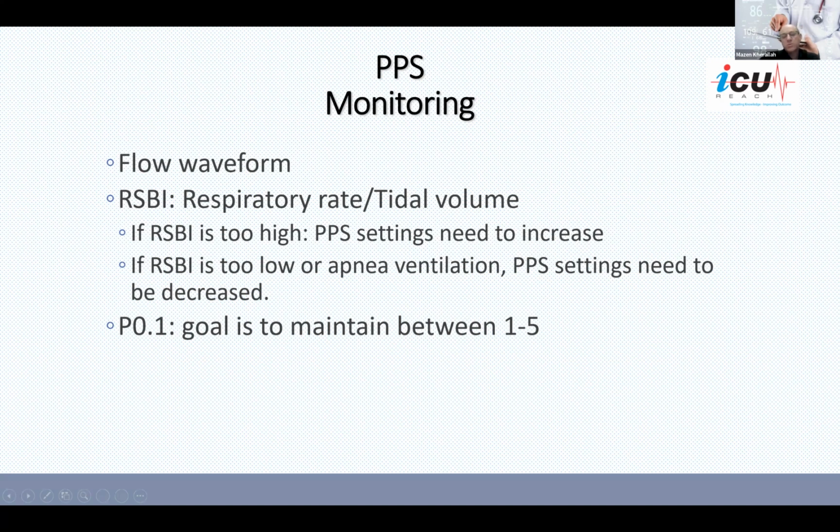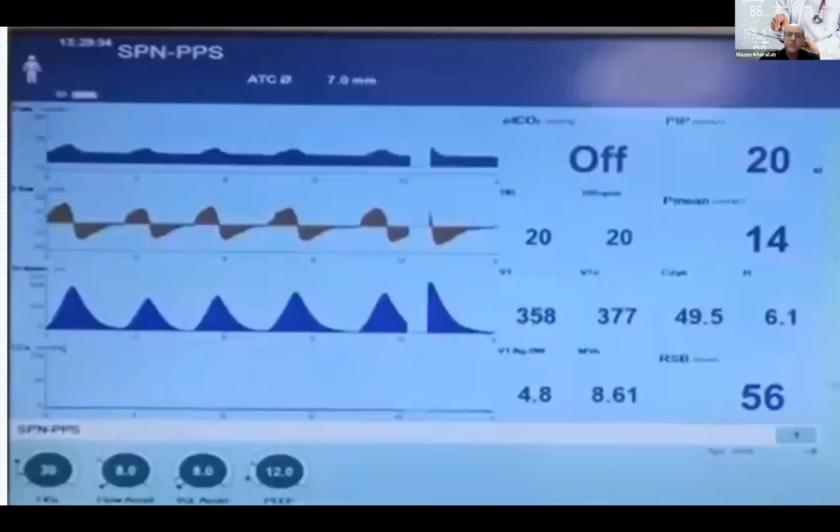So as you see with this mode, we let the patient drive the ventilator, and we maintain efforts of the diaphragm, and we still have our limitations in terms of ventilator protective strategy in patients with ARDS. So I'm sorry, the resolution is not that great for these slides, but those are good examples of PPS on Drager. This is perfect actually.